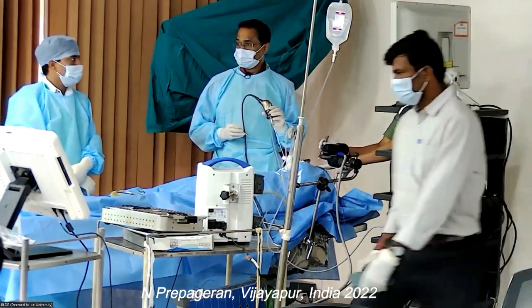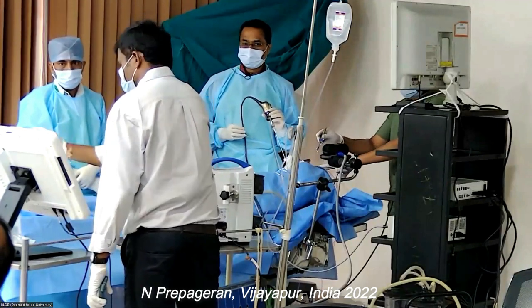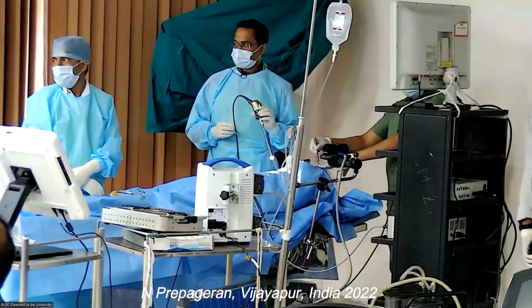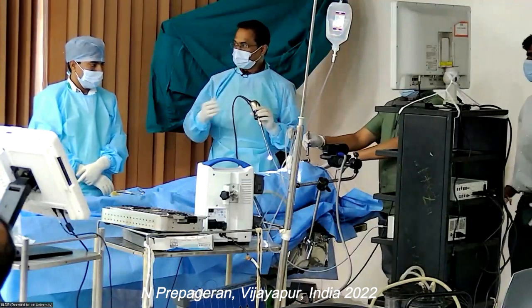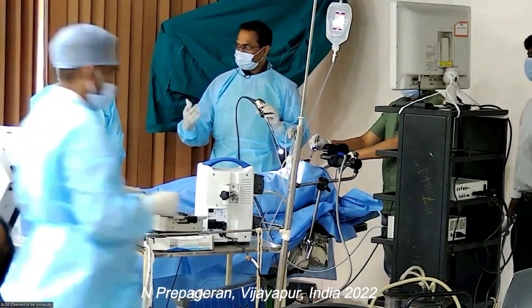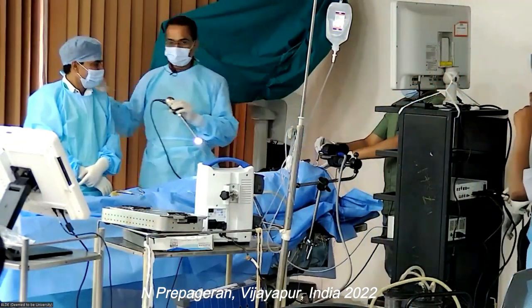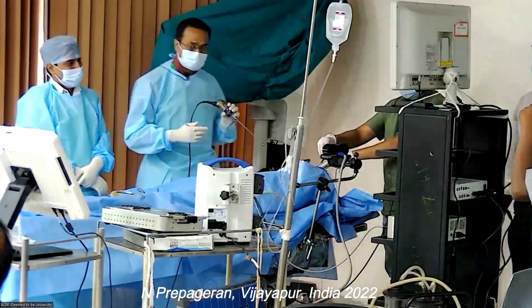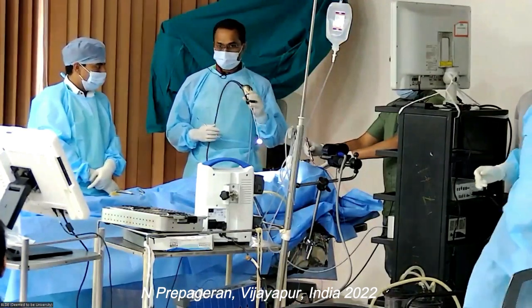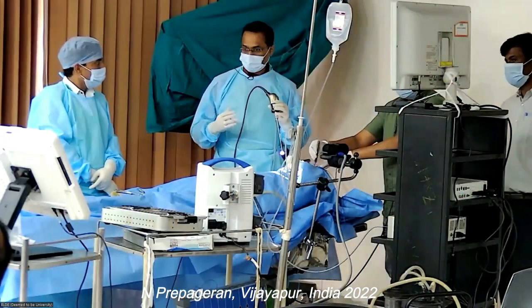Can we start, guys? Sir, can we use an endo holder? So to have both hands free? Because some of the people are using it, especially when you are doing under general anesthesia. But you have a lot of endo holders. Now ask one of your residents to hold for you. You got a new model every year, good looking new model every year. Why you want to buy an endo holder? Then I've got one endo holder next to me. Where's my other endo holder? He left me and went. Okay. So it's better for a person to hold your scope. Then you have a dynamic movement. If you have an endo holder, then your movement is not dynamic.